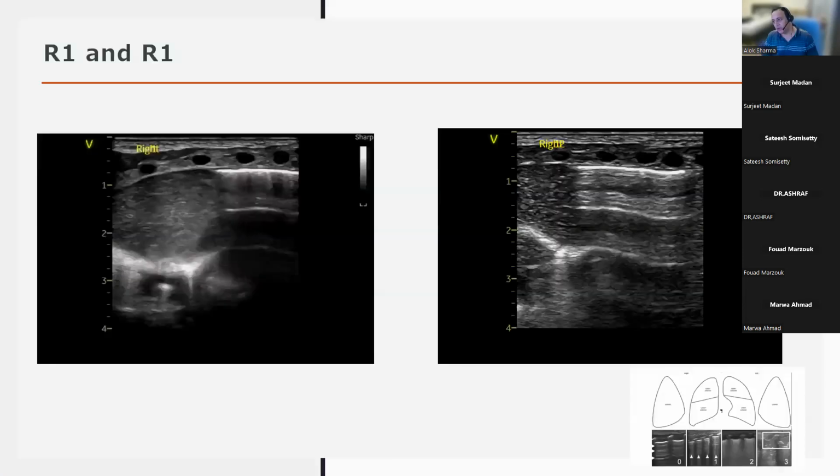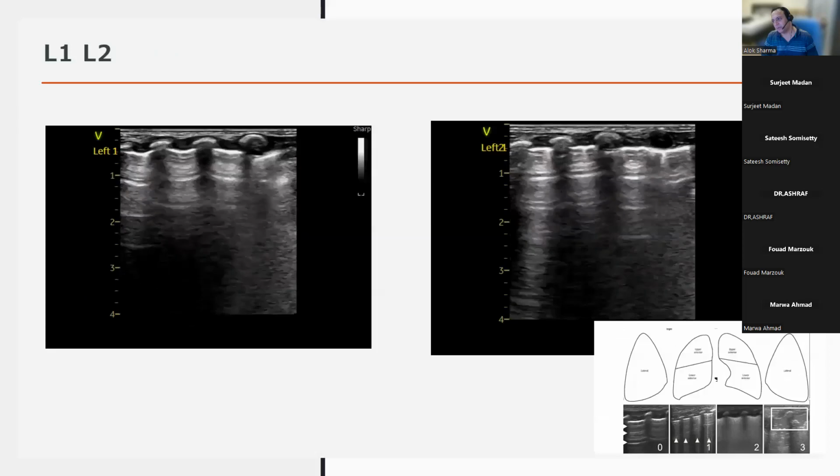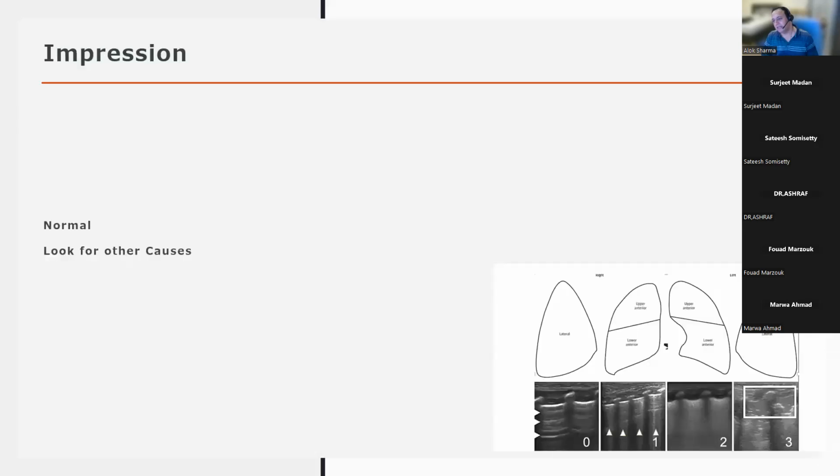As this is a patient of a diabetic mother, should I ask for the echo? Well done. So that is the most important thing from our perspective, is that we basically have a baby who has minimal respiratory distress, a lung that's probably transitioning, so we need to look for other causes. So we did an echo for this baby, and really what we had was elevated pulmonary pressures. We had a significant TR with a bidirectional shunt across the duct, predominantly right to left. So kind of a persistent fetal circulation. We also had a little bit of hypertrophic cardiomyopathy. So really this is delayed perinatal adaptation.